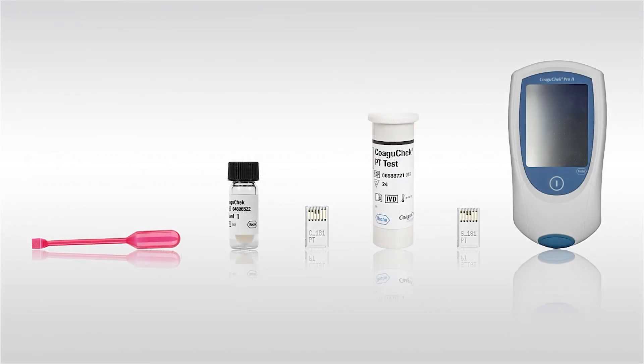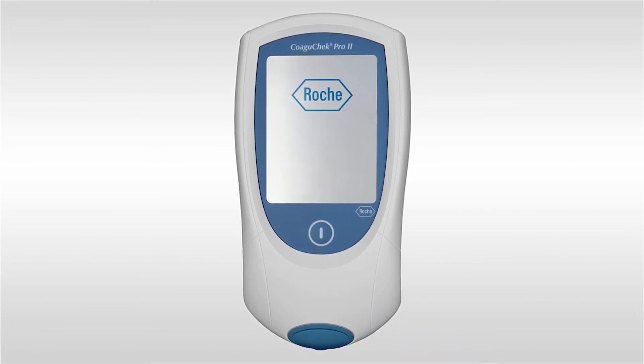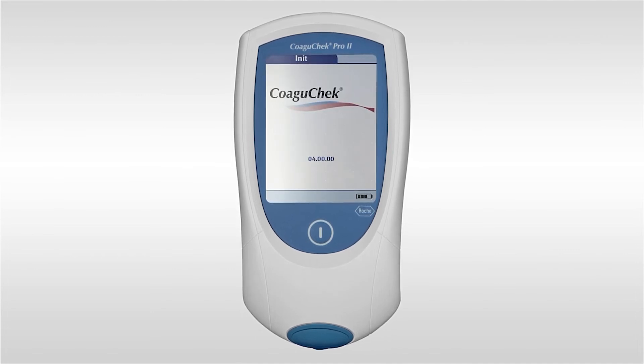To perform a quality control test you will need the meter, the test strips, a level 1 and a level 2 control solution, the corresponding code chips, and two sealed pipettes. Switch the meter on by pressing the power button. Check the battery level and check the time and date are correct. To prepare the quality control solution, please follow the instructions as laid out by the pack insert.